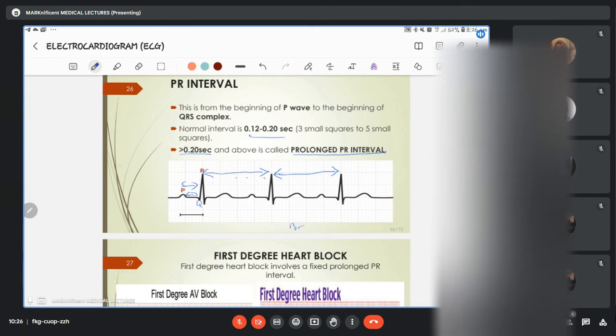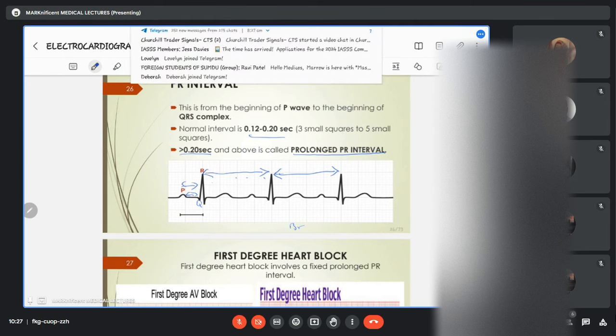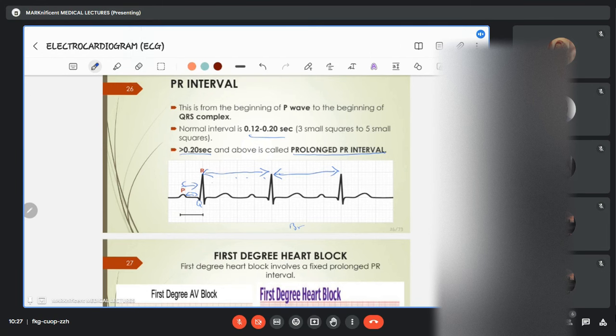Now the ventricles contracting is what? Ventricular depolarization. So the PR interval should be an interval between the contraction of the atrium and contraction of the ventricles. So you can start thinking of, okay, maybe the structure is on the atrioventricular structures or septum. I'm just trying to help you understand this and then apply it to the normal happenings in the heart. But however, just know that when there's prolonged PR, then there's a big delay before the QRS complex will occur.